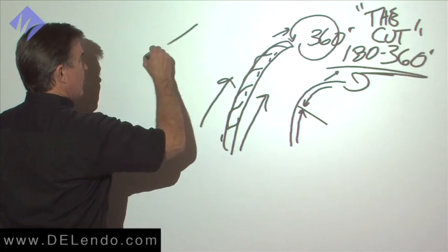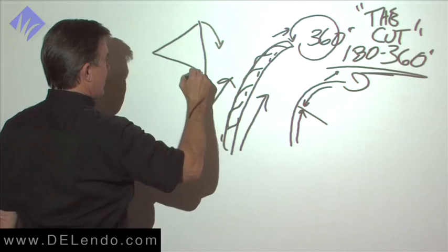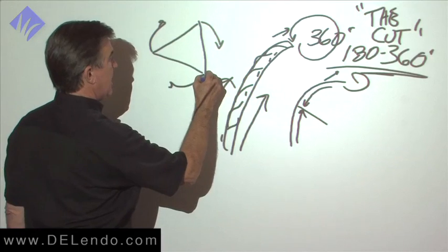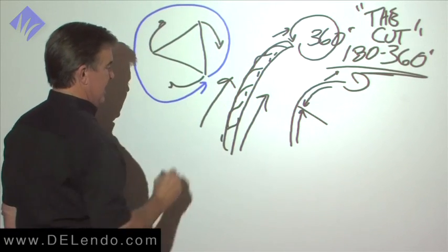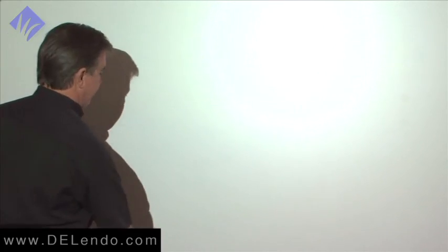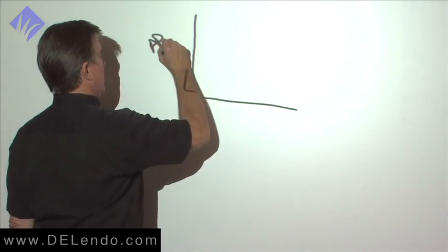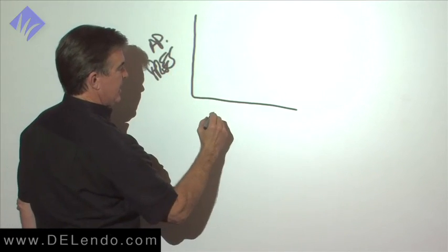So, to reiterate, triangular file, set the blades quarter turn clockwise, and then with apical pressure, a full 360 counterclockwise. This is what it looks like, and this is a technique sensitive method. Apical pressure, and this is time.